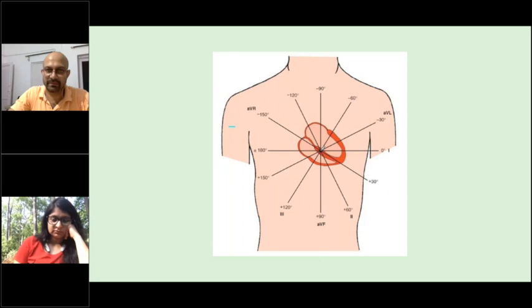So 0 degree, along 0 degree. No, it was 9. Now we counted, there were 9 small squares in the positive direction. Yes, sir. Just make a sort of a small graph paper on this. 1, 2, 3, 4, 5, 6, 7, 8, 9. So here you have practically 9 small squares in the positive direction on lead 1.